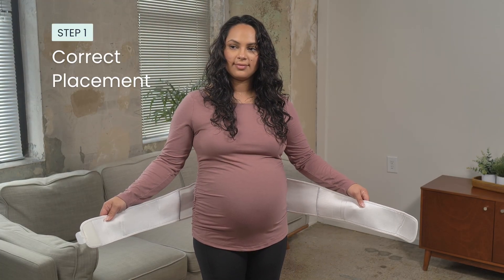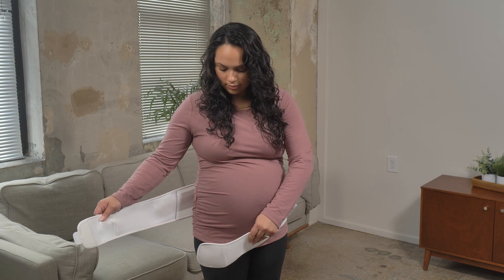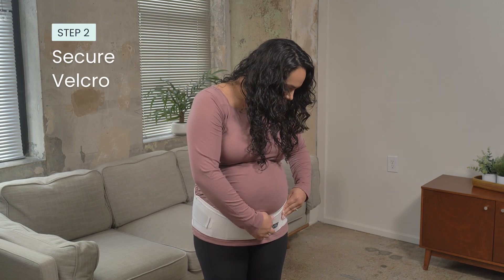Step 1: positioning of the pregnancy back brace. First, ensure the straps are positioned in the back and the velcro is attached in the front. Secure the front of the band below your belly button, cradling your bump.